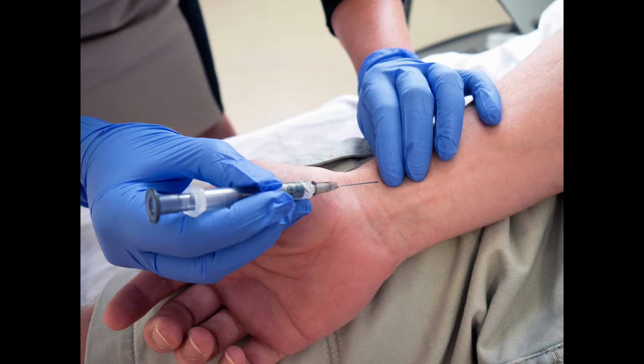Now, key points for documentation of an arterial blood gas analysis. You want to make sure that you're writing down the indication for the procedure, the time that the procedure was performed, and quite importantly, the location that you performed the procedure, whether it was a right or left radial artery, or perhaps an artery somewhere else on the body.